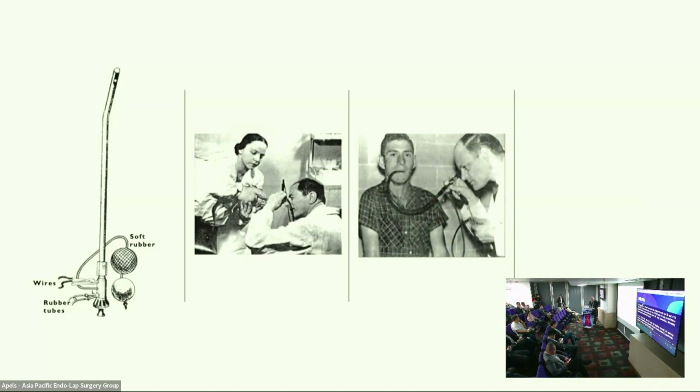And then there came a time when it's just an eyepiece without any camera or monitor. Patients were seated this way, and I was able to encounter flexible endoscopes that use fibers still. So there's no CCD camera at the tip of the flexible endoscope. They still have to attach an eyepiece to that flexible endoscope to be relayed into a monitor so you can see what's inside. So when those fibers get broken, you'll see small peppercorns on the screen. Those are the old type of scopes that we had.